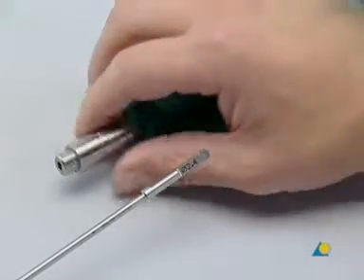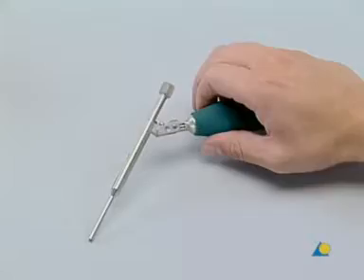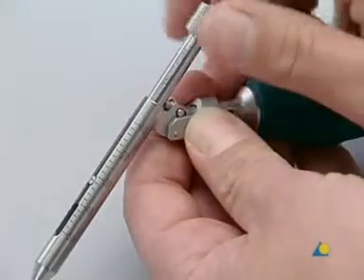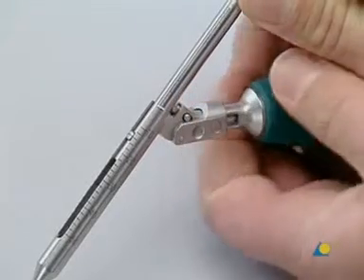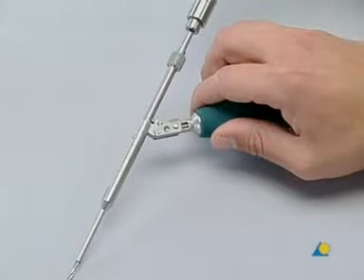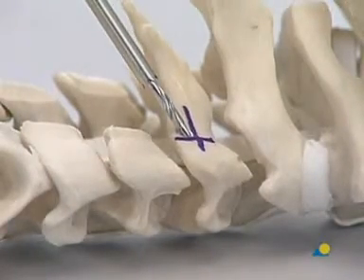The 2.4 millimeter drill bit with stop is connected to the handle with quick coupling. The drill sleeve is set to 14 millimeters, which is the most common screw length. The latch is slid back to release the inner tube of the drill sleeve. The position of the inner tube is adjusted and the depth can be seen in the window. The drill is then inserted into the drill sleeve and placed at the correct angle. If necessary, the drill sleeve can be adjusted by 2 millimeters to reach the required depth.